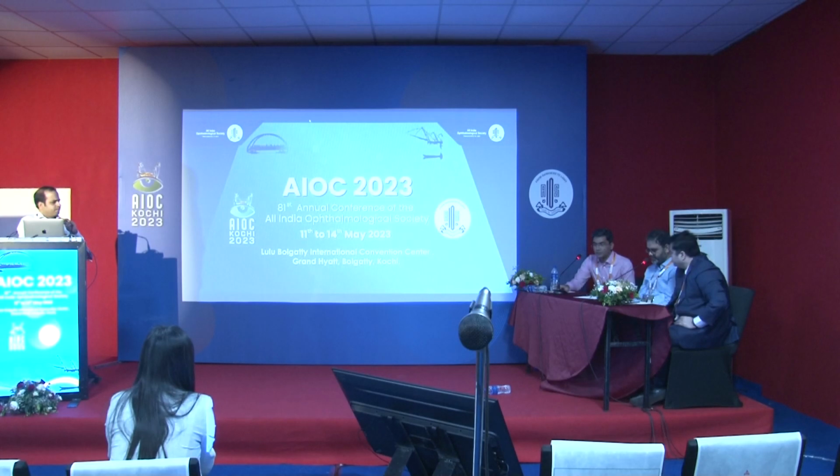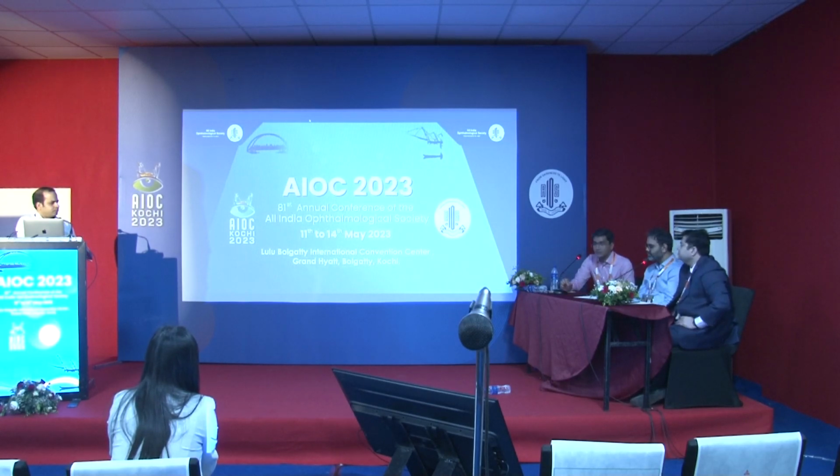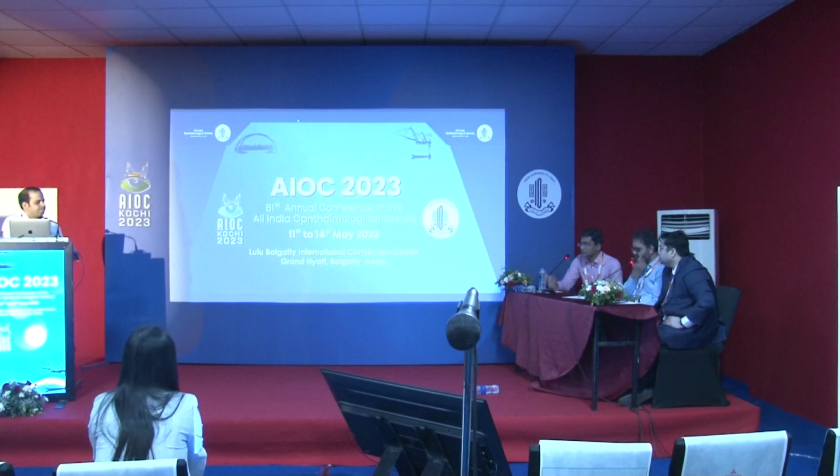One more thing which I would have wanted to do was to peel the ILM and not to do laser at the site of that drainage retinotomy, because once you peel the ILM, the chance of detachment is very, very low. And as you could see, after the laser the retina also gets thinned out. We could have added laser post-op, like a focal barrage, with a little more control, because whenever we use a laser intra-op, obviously the distance and the power and all is completely different. The scarring is different, but fantastic.